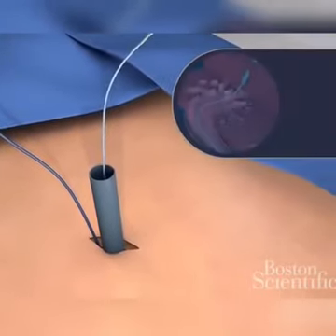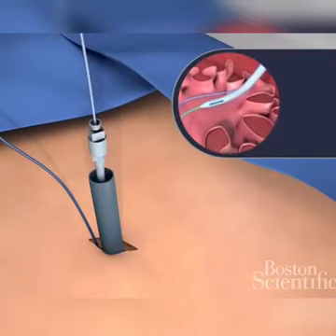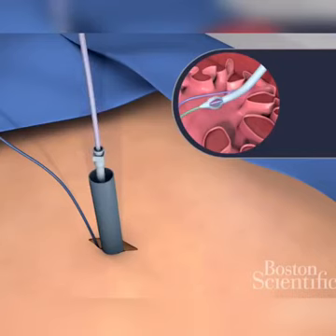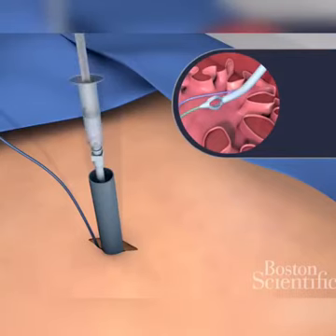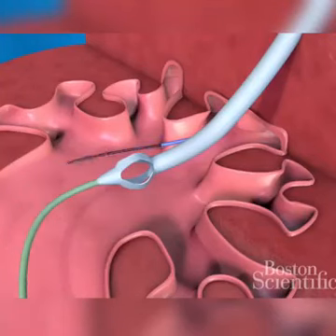Insert the nephrostomy drainage catheter into the sheath over the working wire. Remove the inner stylet from the catheter to enable the catheter to open inside the kidney. Remove the stiff working wire from the catheter. Using the syringe, inject contrast through the catheter to confirm its proper placement on X-ray. Remove the renal sheath and the remaining guide wire to complete the procedure.